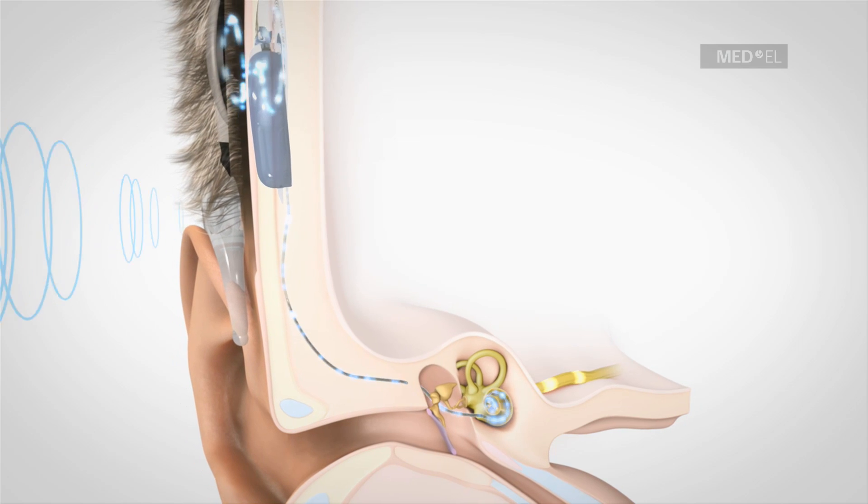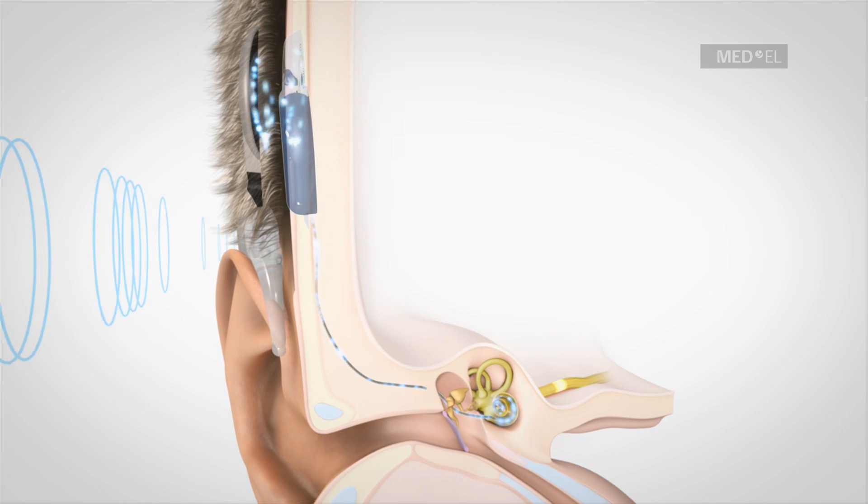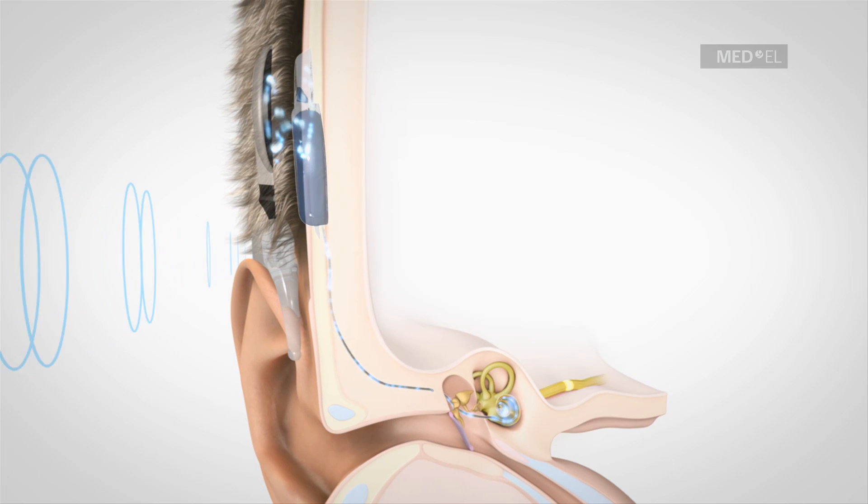In this way, and for the first time, it is possible to use a medical device to replace a human sense.